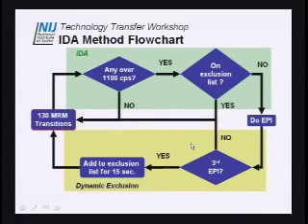And this is sort of a flow chart of the way the IDA works. You start here. The first question asked, this is at the end of my MRM transition, is: are any of these drugs over 1,100 counts? Okay, well, carisoprodol is over 1,100. Alprazolam is also over 1,100. Are any of them on the exclusion list? No, none of them are on the exclusion list yet, because this is the first time I've seen both of them. All right, well, do the EPI of the tallest one.